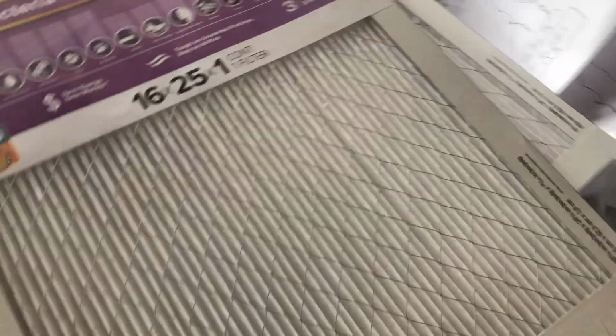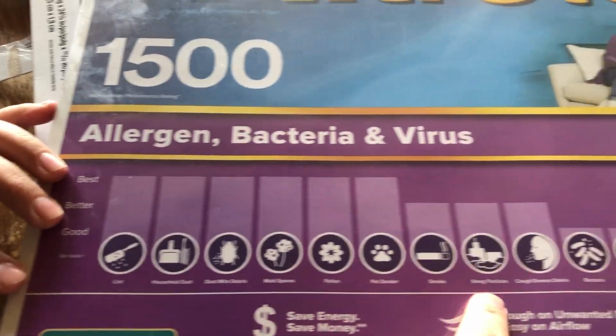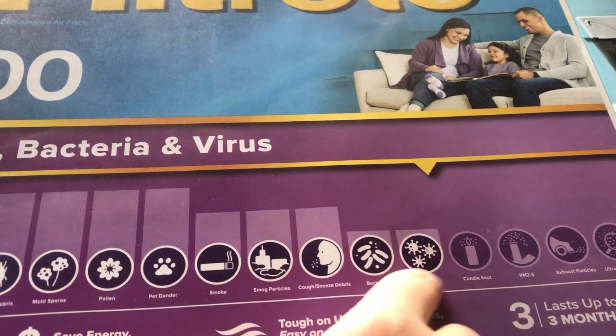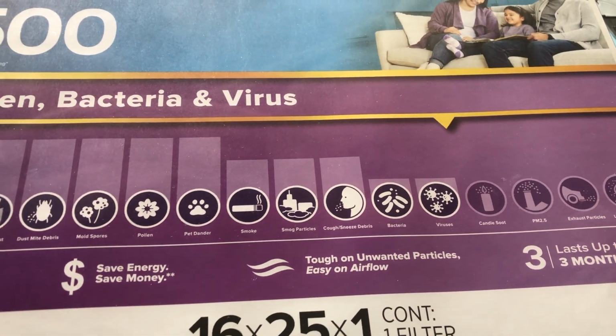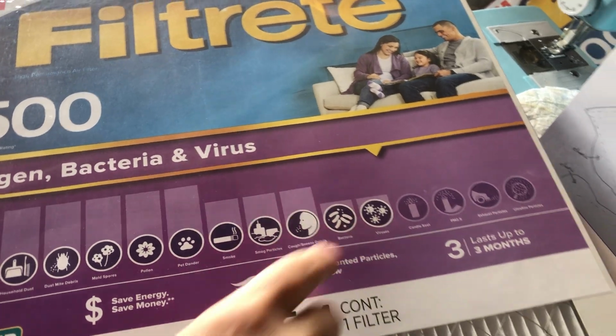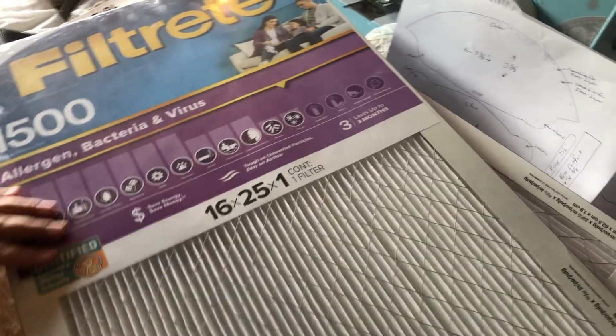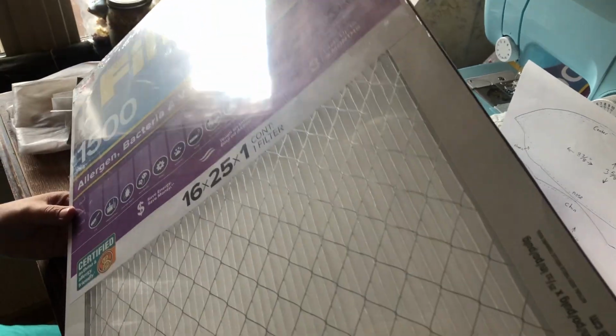And these filters are supposed to help with everything. The last thing on the list is viruses. This is the best filter I could find down there at Ace Hardware. A lot of your furnace filters don't say they will filter out bacteria and virus. So these purple labeled ones are supposed to do that. And it's like, okay, so I bought this.